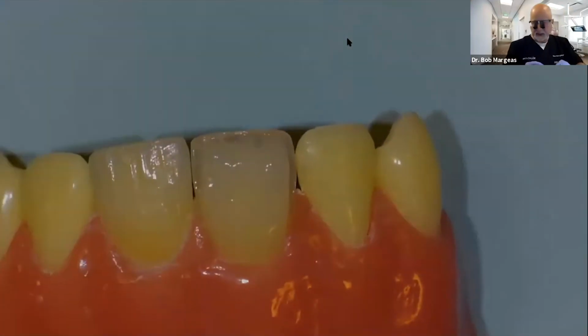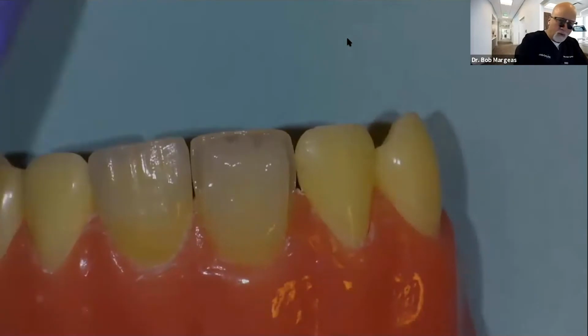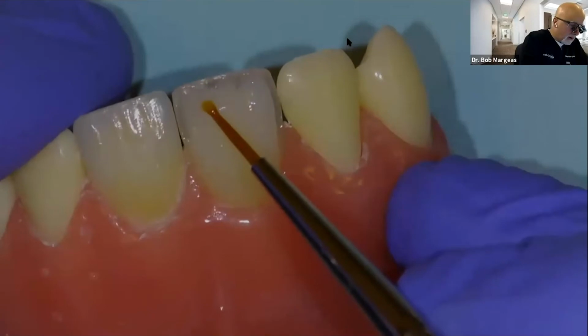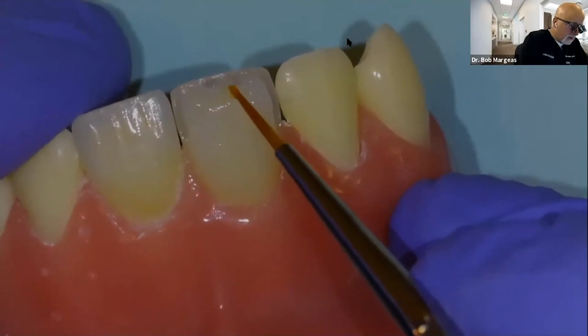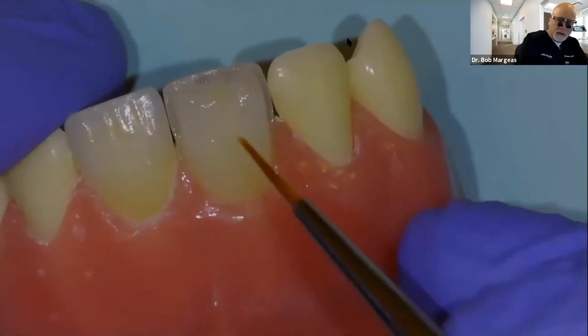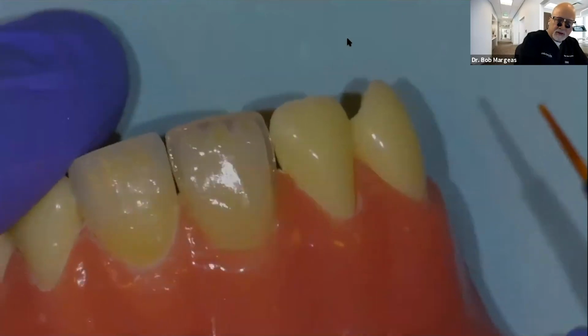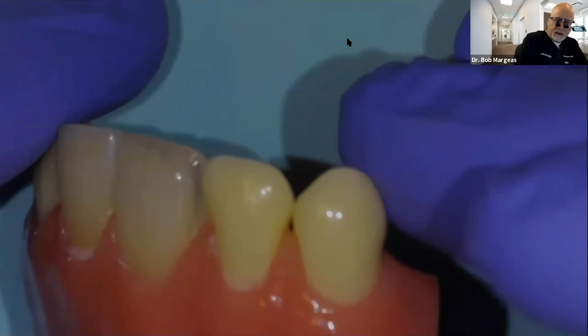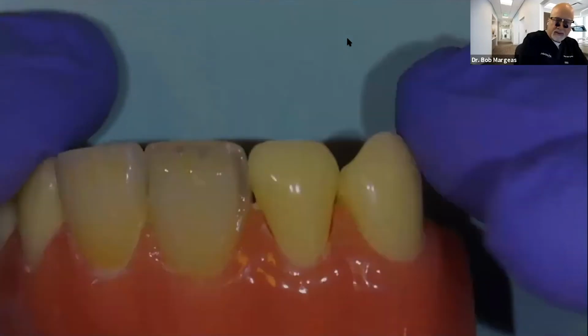Now, how do I get the chroma at the tips of the dentinal lobes? Well, what I like to do is this. I'll take a mixture. This is a mixture of the honey yellow brown and light brown of the Creative Color. And I'm going to watch how I can touch the tips of this here. One, two. And you can see how that can start to shine through, and it will give it some depth. Notice the violet there? It's going to give it some depth once I place my enamel white.